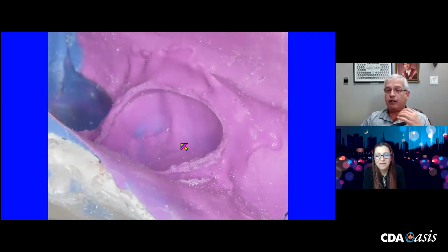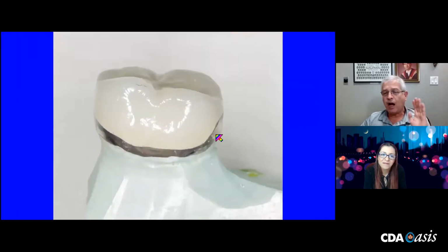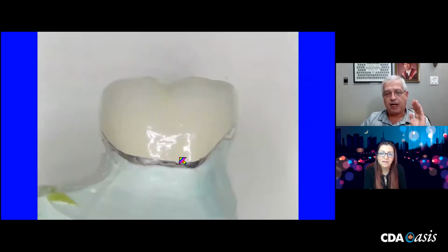So look, I can do better. We need another impression. Sorry, I have to get you frozen, and we just have to do it again. And we did. So here's the second impression compared to the first one. It's very clean all through here because I want to deliver, as I said, the best fitting crown, the best fitting seal I can muster.